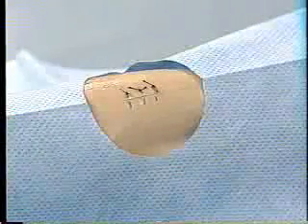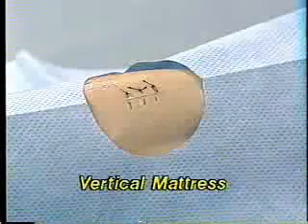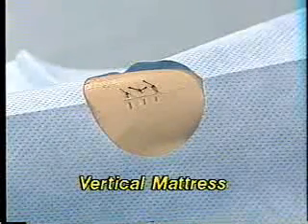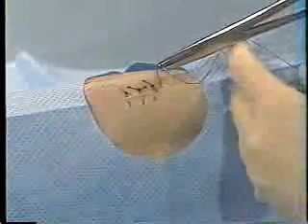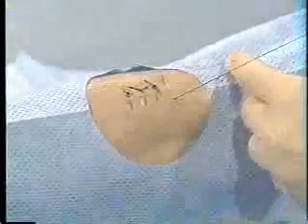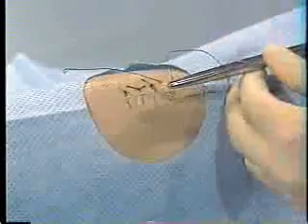Now I will show you the vertical mattress technique, which is used to ensure that the edges of the wound will evert or turn outward instead of turning inward. Start the stitch the same way as for a simple interrupted. Before tying the knot, turn the needle around and go straight back to the other side of the wound, catching just the very thin edge of the wound on each side.